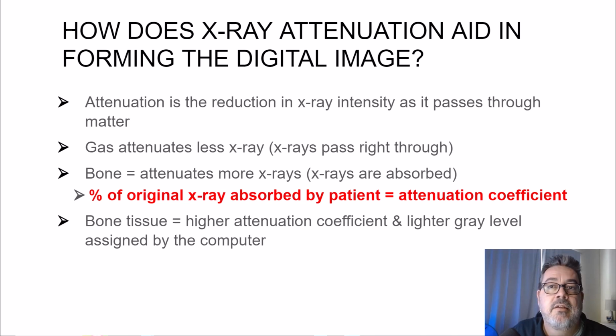Think of it like nighttime photography. Have you ever taken a picture on your cell phone in low light settings? Chances are the signal's not great. You're probably going to have a lot of blur, a lot of image noise. The same thing can happen with X-rays. If you get garbage in to the detector, you're going to get garbage out of the system.